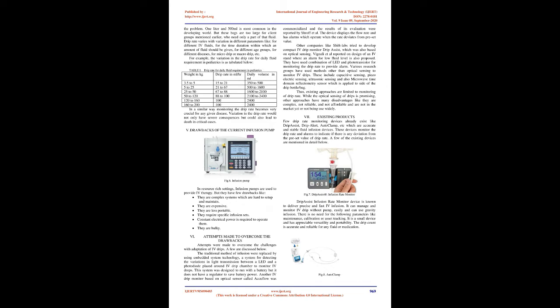Over-infusion is a situation where more fluid than intended is delivered to the patient. Consequences of over-infusion include metabolic disturbances, shortness of breath, high blood pressure, electrolyte imbalance, speed shock, etc. Overhydration must be prevented, particularly for patients who require small volumes of fluid. Overhydration can lead to edema and death. The problem of flow control of drips affects the following client groups: infants, children, geriatric, organ impairment or organ failure patients, patients with impaired cardiovascular status, patients with major sepsis, post-operated patients.